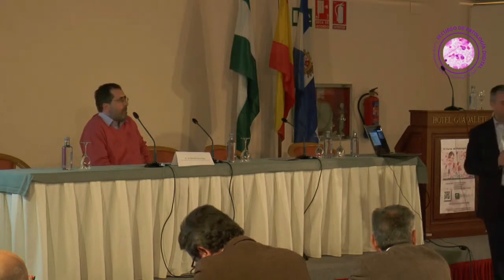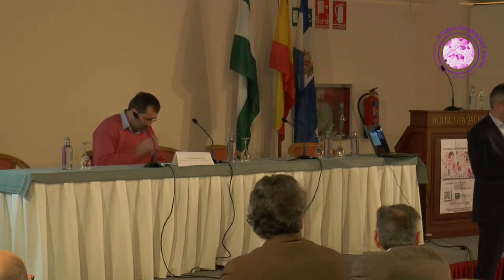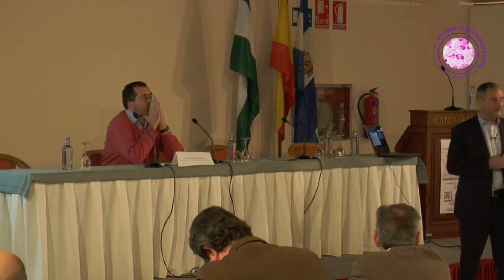So you're asking that there are many different parameters that could cause variability, and one of them obviously is thickness of slides, and that is definitely true.